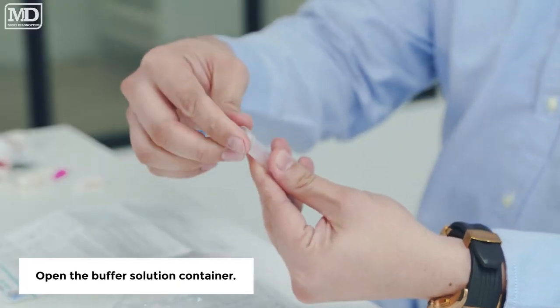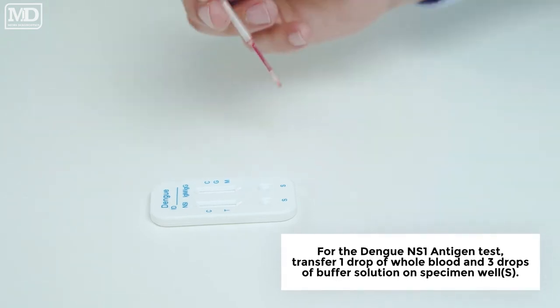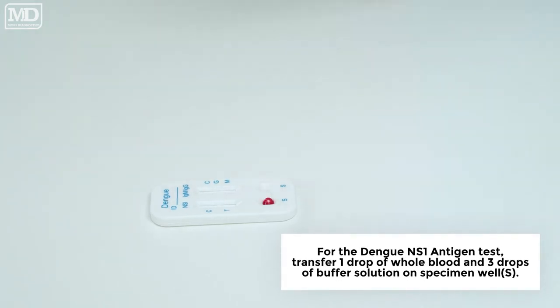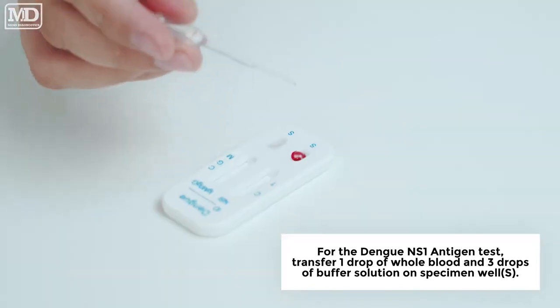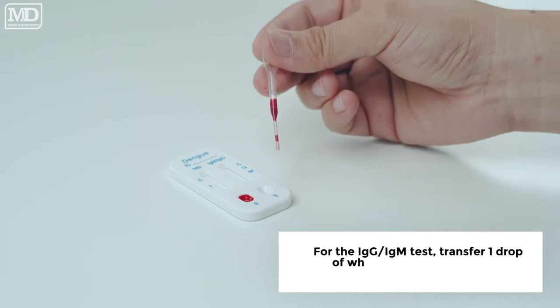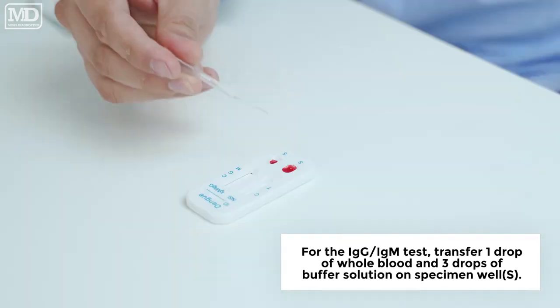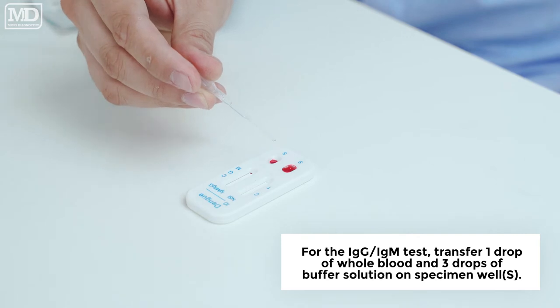Open the buffer solution container. For the Dengue NS1 Antigen Test, transfer one drop of whole blood and three drops of buffer solution onto the specimen well. For the IgG-IgM Test, transfer one drop of whole blood and three drops of buffer solution onto the specimen well.